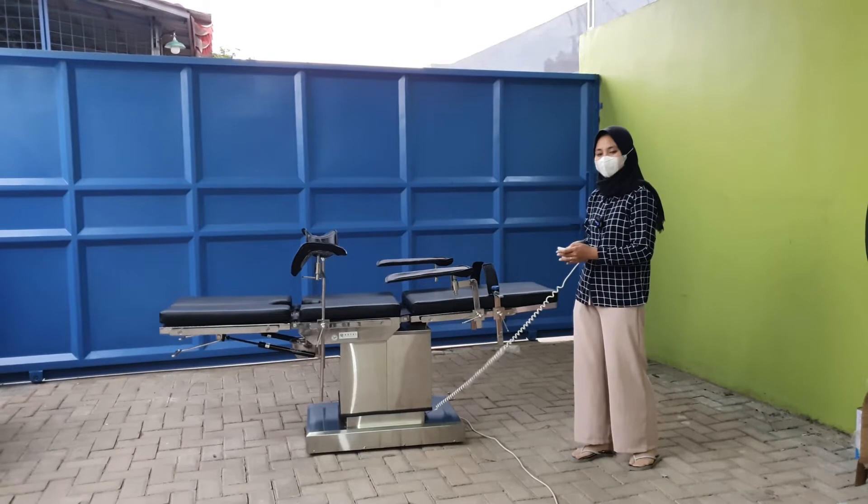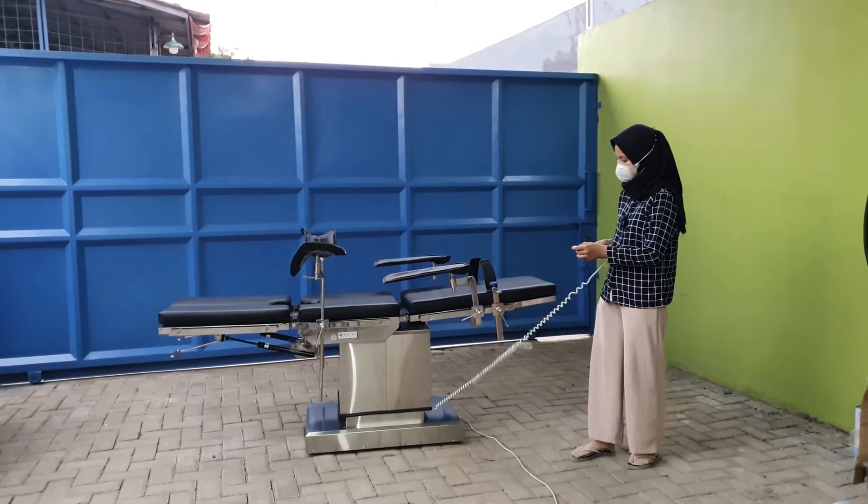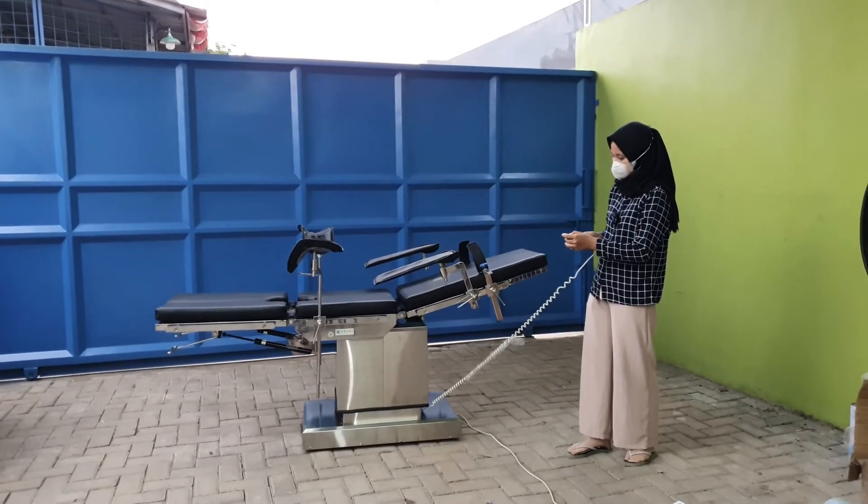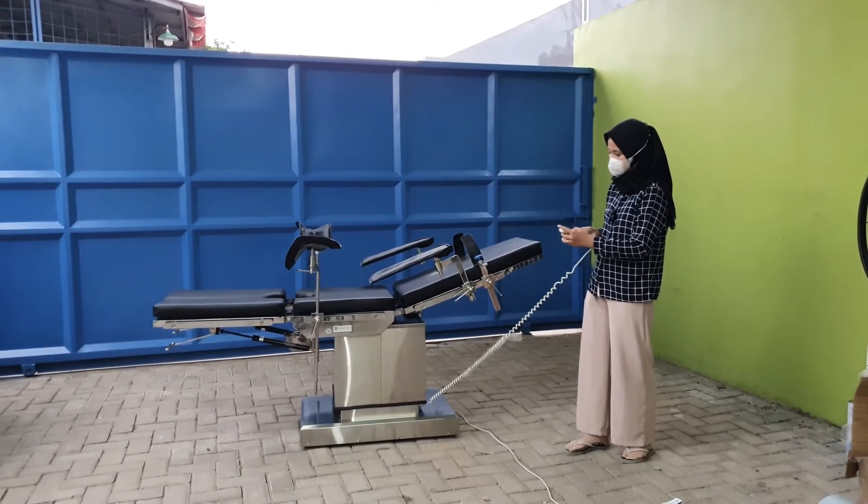Untuk meja operasi elektrik ini, fungsi pertama yaitu untuk menaikkan bagian punggung. Yang kedua yaitu bagian bokong.